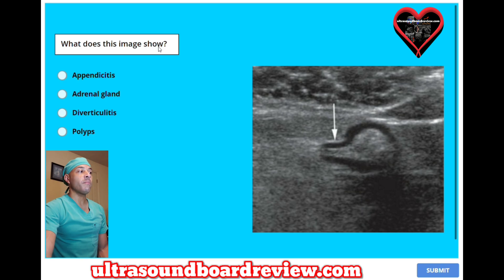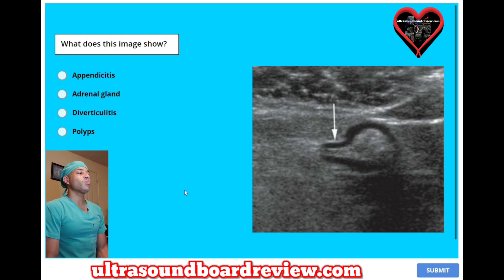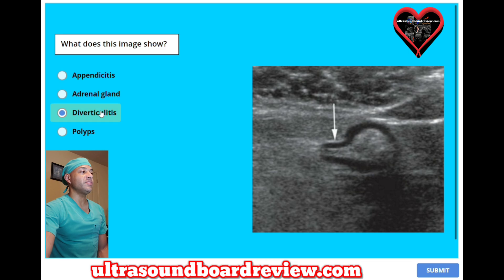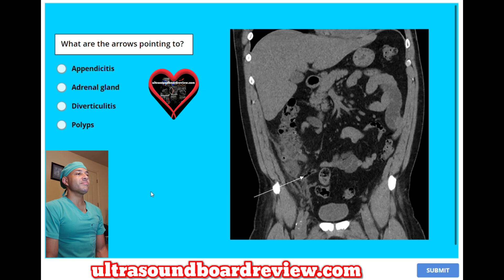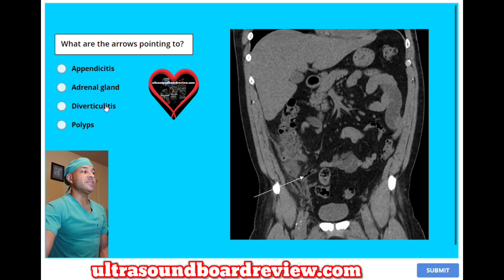What does this image show? A, appendicitis. B, adrenal gland. C, diverticulitis. Or D, polyps? What are the arrows pointing to? A, appendicitis. B, adrenal gland. C, diverticulitis. Or D, polyps? The answer is C, diverticulitis.